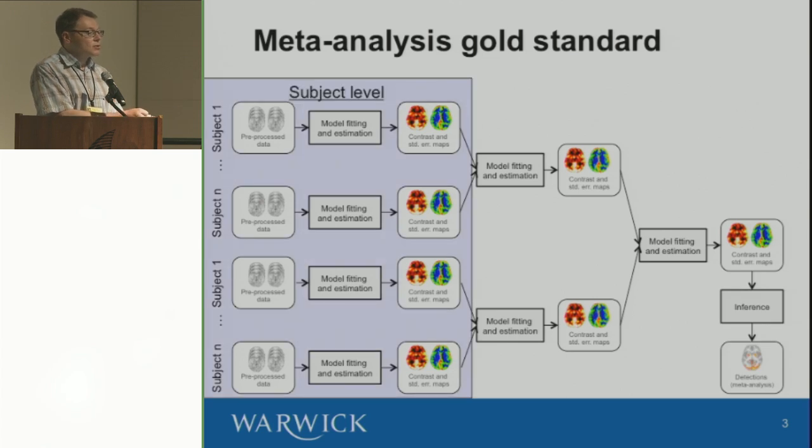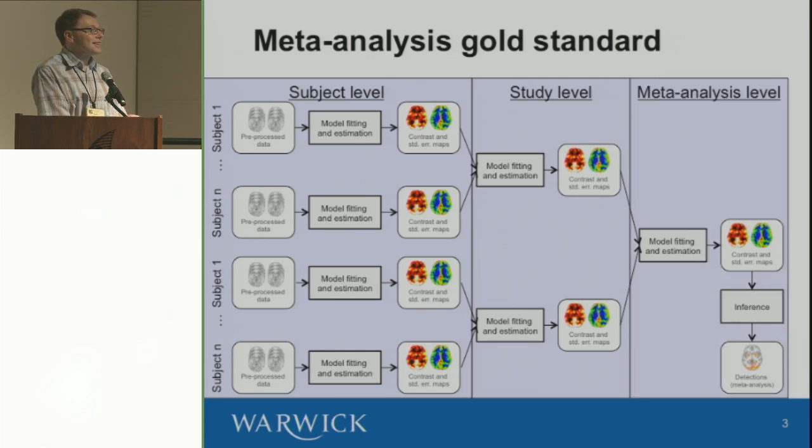Okay. And so this breaks down to subject level, study level, and meta-analysis level. So this would be called a 3-level analysis in FSL for the subject, study and meta-analysis levels. Okay, next.